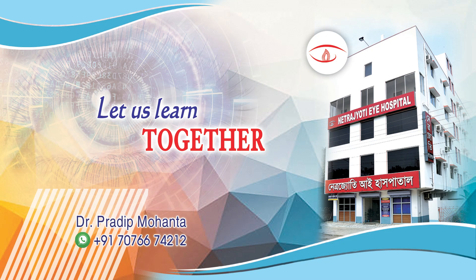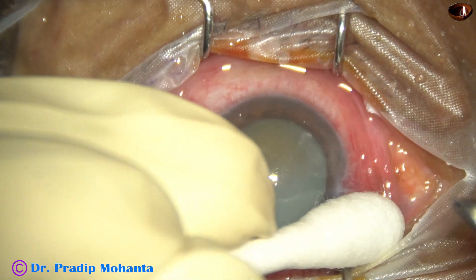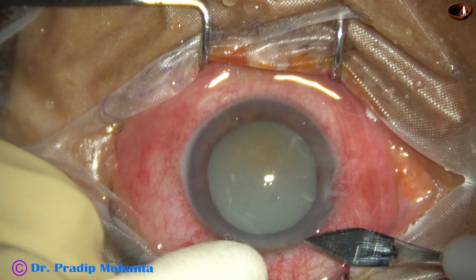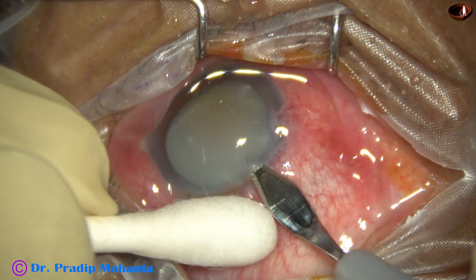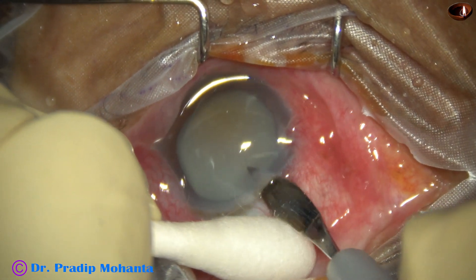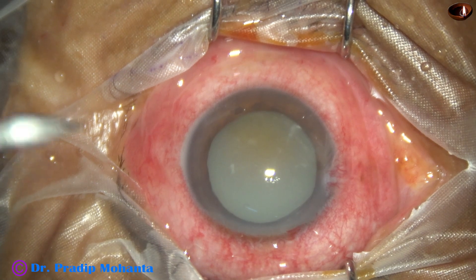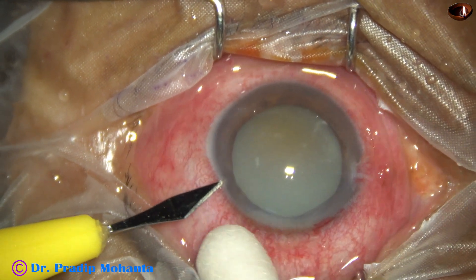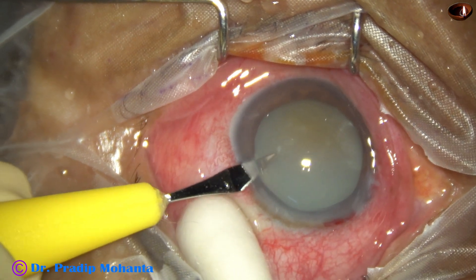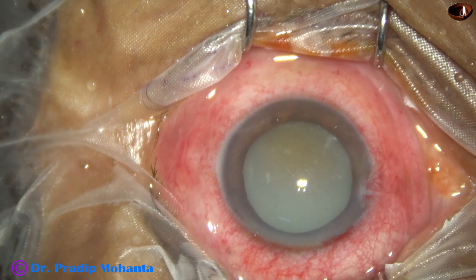Safety measures at every step — let us learn this. This is a hypermature morgagnian cataract; let us observe management of this case. This is the main incision with a 2.8 millimeter steel keratome. This patient has come with intraocular pressure of 30 millimeters of mercury and is going to develop intractable phacolytic glaucoma unless we take up the case for surgery as soon as possible.